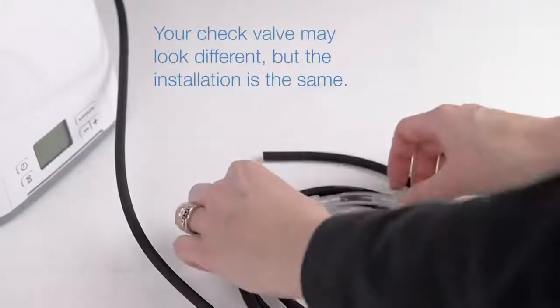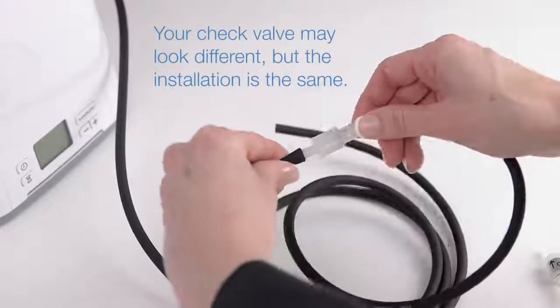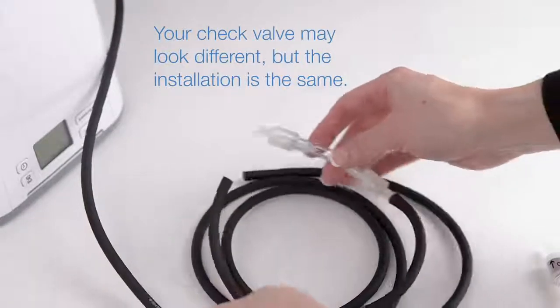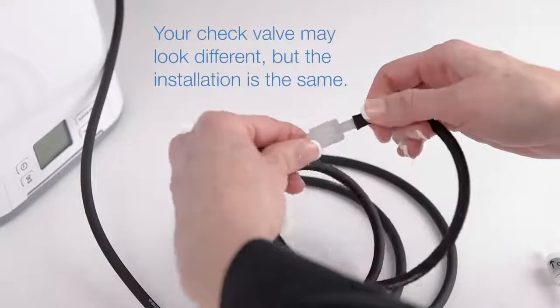Grasp the barrel of your current check valve firmly and pull the tubing away. It may be necessary to use a twisting motion. Repeat to disconnect the tubing from the other side.